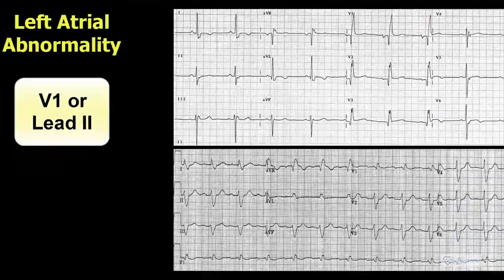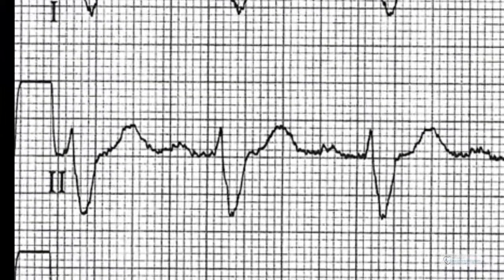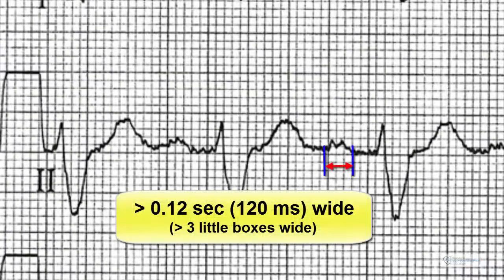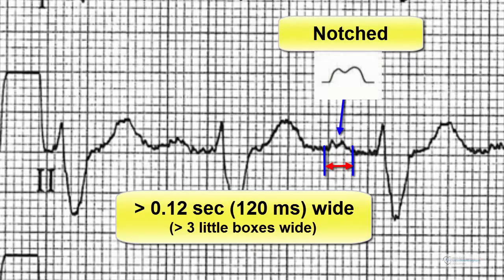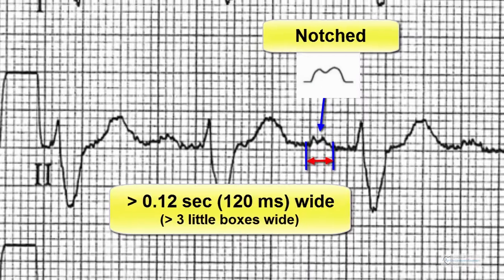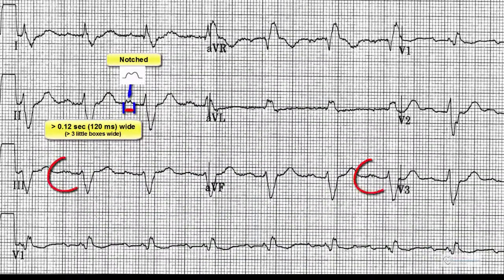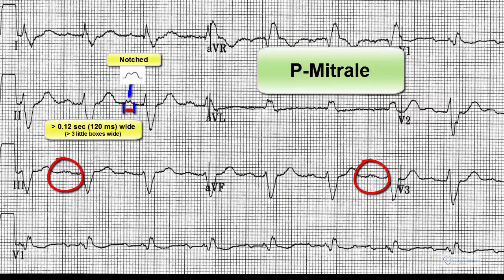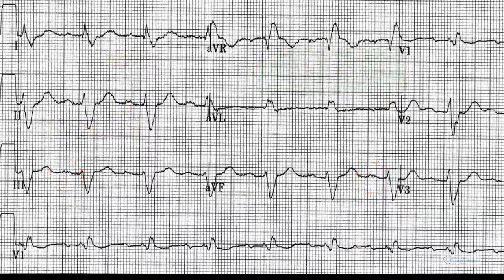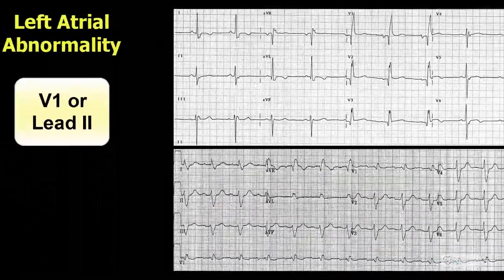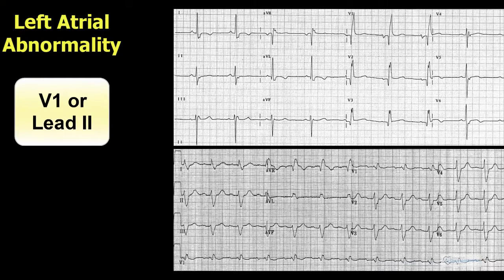In lead 2, as in this other electrocardiogram, the P wave may be greater than 0.12 seconds wide and is usually notched. This may also be seen in lead AVF and lead 3. This pattern in the past was referred to as P mitrale. It is not necessary to have both criteria present for the ECG to be read as left atrial abnormality.